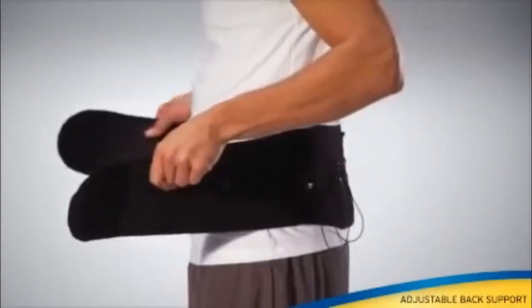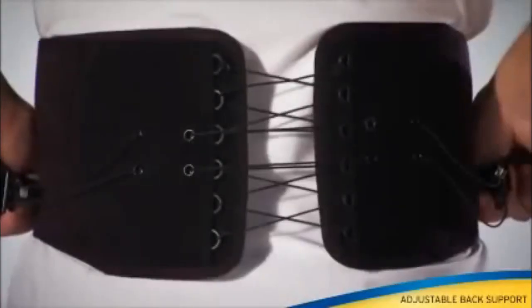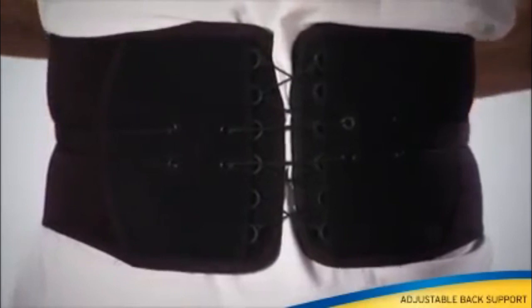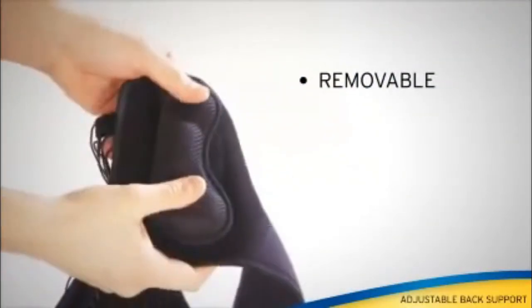The adjustable back support is designed for lumbar region back pain due to muscle fatigue or strains. Dual pull cord system for quick and easy adjustments. Removable lumbar pads cushion and support.